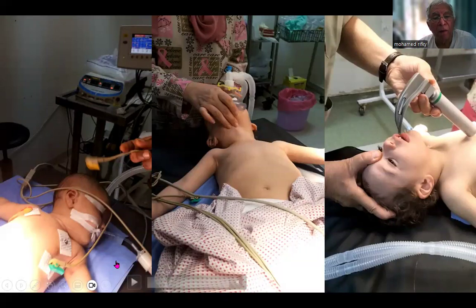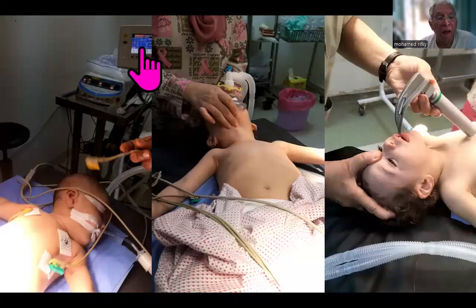This is the last thing about anesthesia in kids. As you can see, this is the patient sleeping with three electrodes and the tracheal tube placed, connected to the anesthetic circuit. And this is the setting of the ventilator.